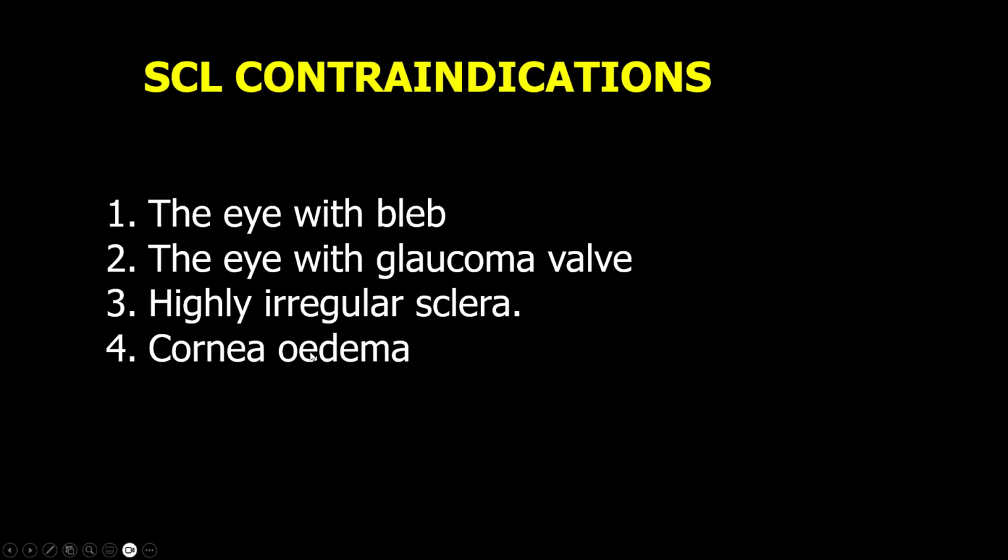In cases of corneal edema, this is very important. In cases of corneal edema, it is not recommended to fit scleral contact lenses. The reason is simple. When you have scleral contact lenses, there's a tendency to have hypoxia because of poor oxygen permeability. Of course, we're going to see a bit of that in the course of this presentation.